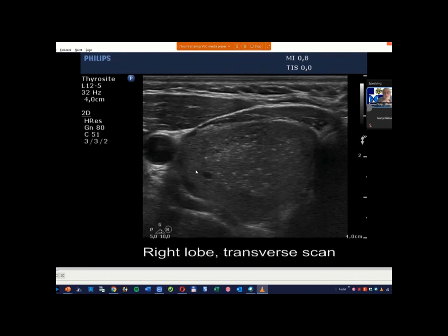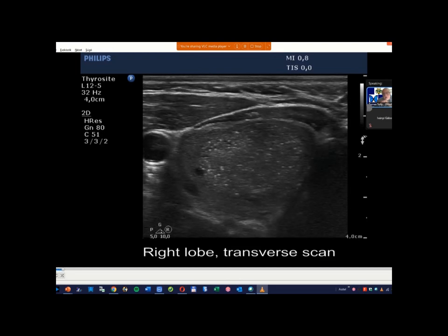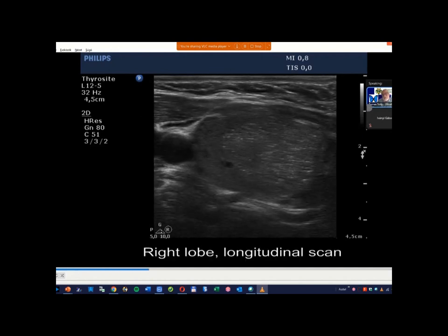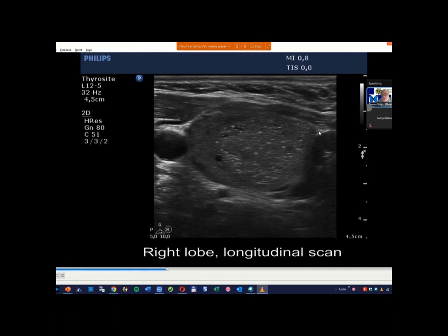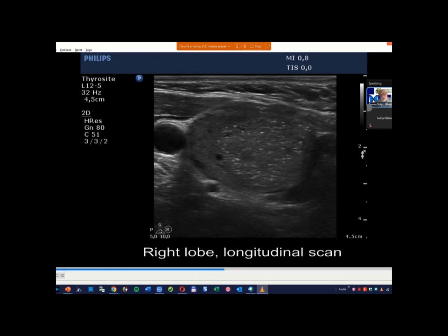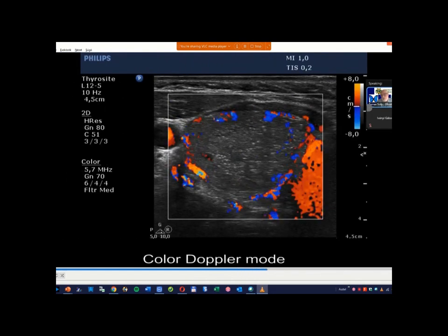So first, here is the nodule and very tiny cystic areas. The nodule is practically almost completely solid. It does not fully exclude the possibility that this has tiny cystic areas, but this is not a usual nodule with cystic degenerations. The second consideration. Okay, here we see anechoic parts and dorsal to this echogenic lines, but be aware that more of the echogenic granules are lines and not granules. Here is a granule, here is another, but the prevailing parts of the echogenic figures are lines. So there are two intranodular echogenic figures, two kinds, which present together lines and granules. These are backwall figures and proliferation of connective tissue.